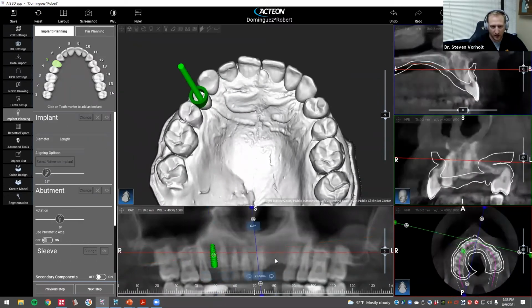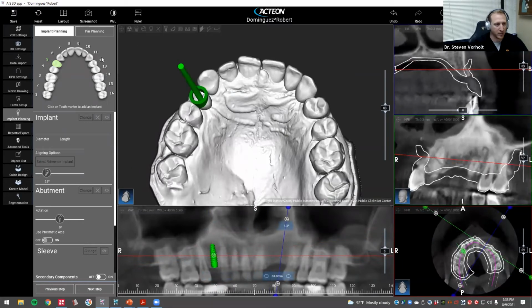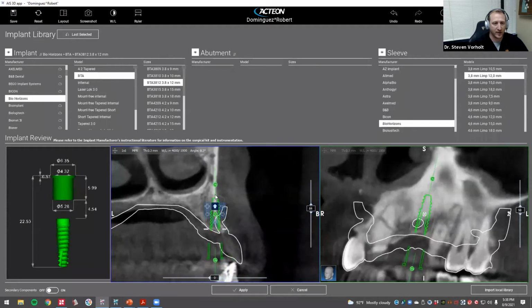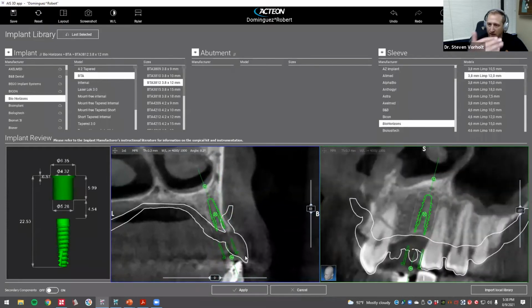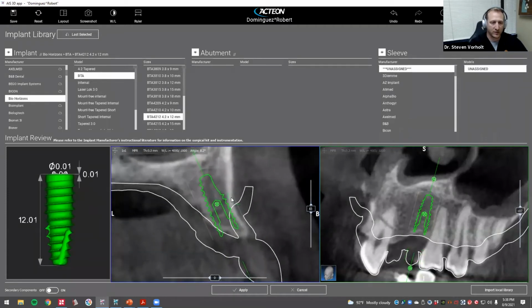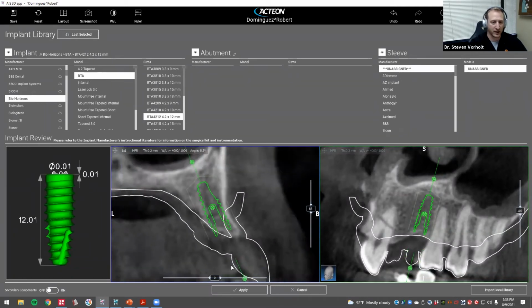All right, now we're going to go over to number 11 and the upper left canine. And this is a bit of a tricky one too. So now upper left canine, I know I'm already planning on cantilevering number 10 off of number 11. So hopefully I can get a slightly larger diameter implant into this site. So we're going to try to go with the 4.2 by 12. And we'll zoom in here a little bit. We can see this is a pretty significant undercut. We have a defect here from the canine being lost for a couple of years. So we're going to place this implant a little bit deeper.